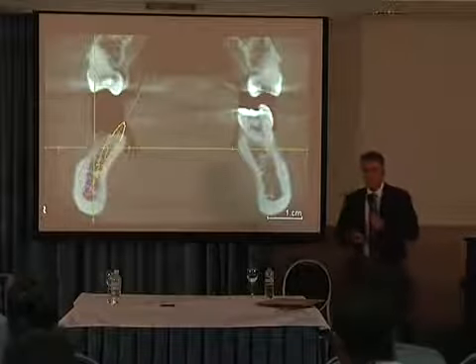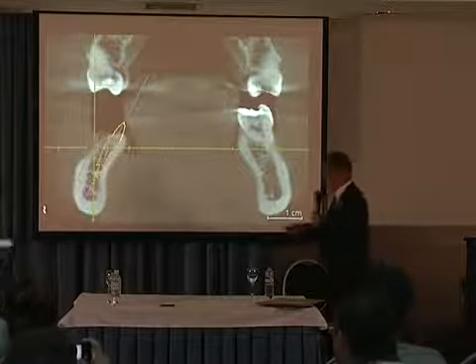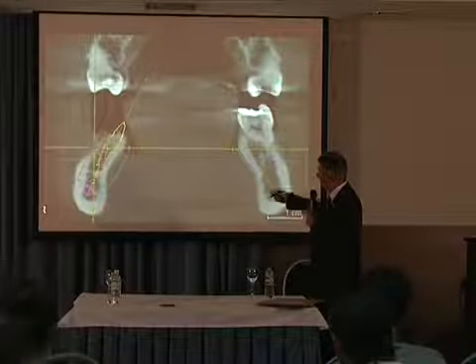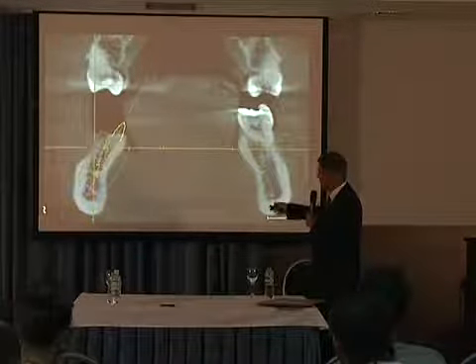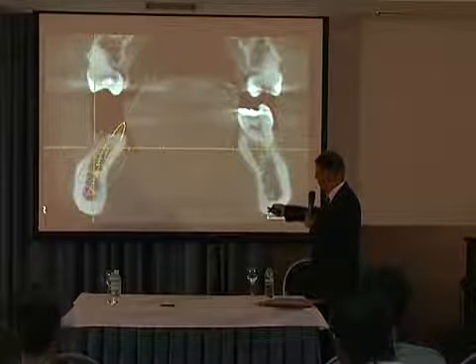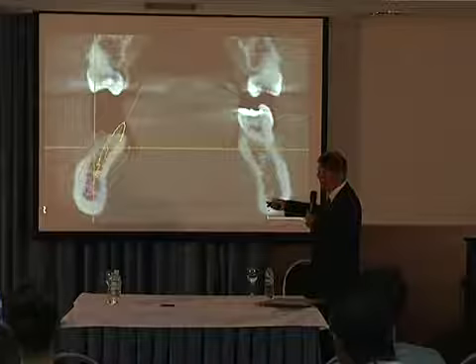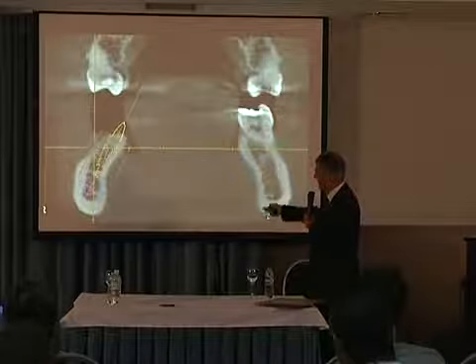And a 3D diagnostic shows us when we just want to place the implant in the remaining bone, we cannot place it under prosthetic aspects because we have a perforation here. We have not enough buccal plate, so without further augmentation is not to deal here.